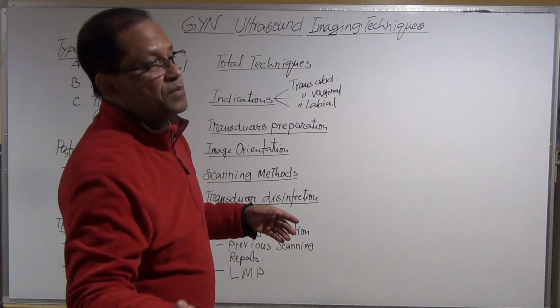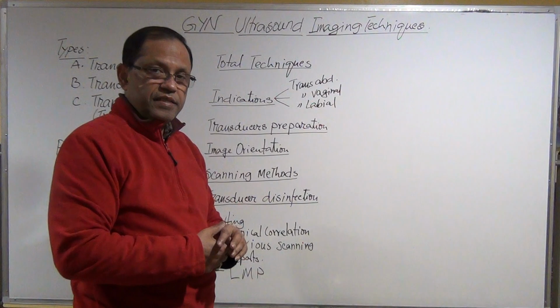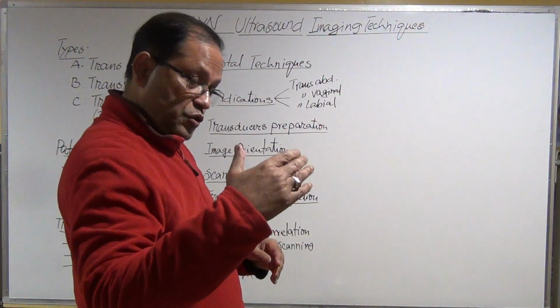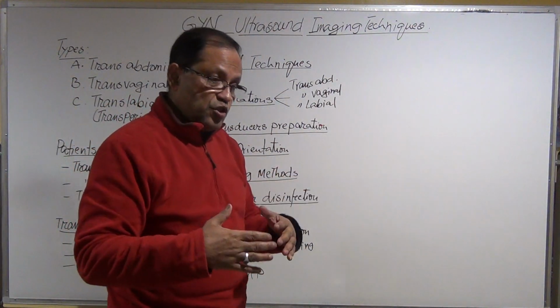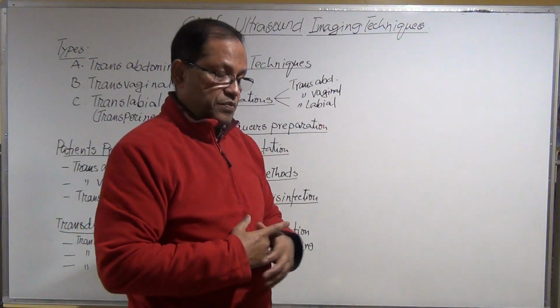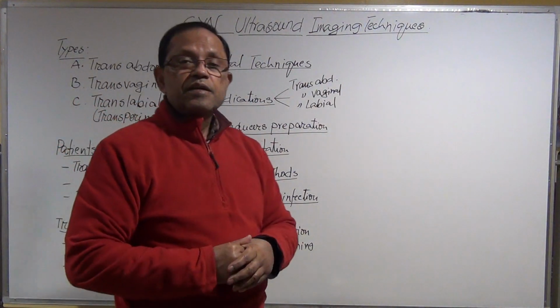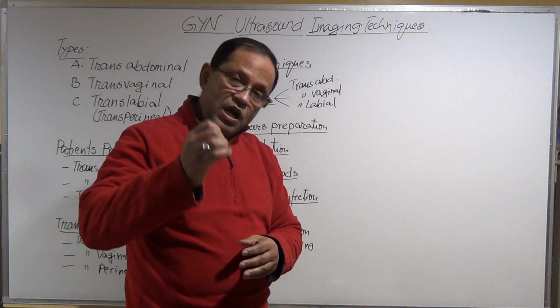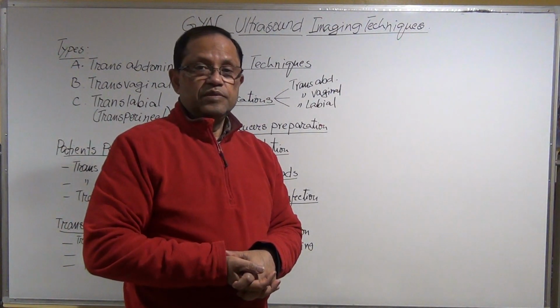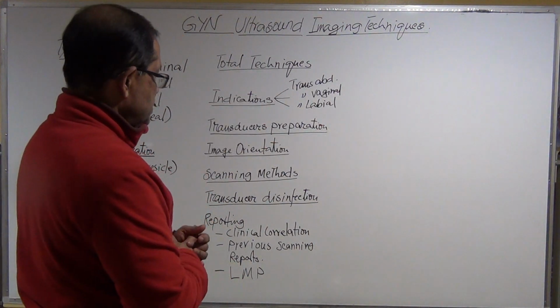It can be contaminated with the transducer, and the transducer needs to be disinfected, and precautions taken when you are going to prepare it for use. Also, for the translabial approach, you need to cover the transducer too. And we're going to use different types of transducer for each purpose.